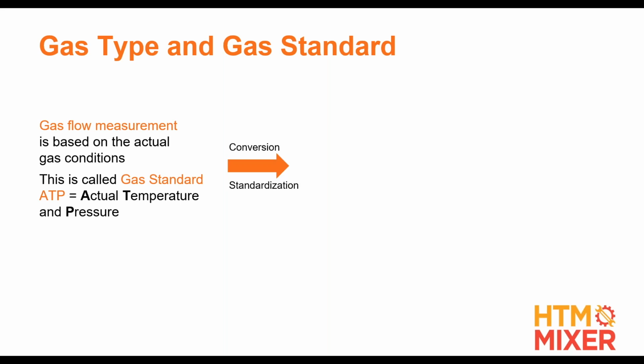How many people have heard of other gas standards, things like STP, BTPS, AP21, things like that, right? So all a gas standard is doing is adding an offset value to your ATP measurement based on the conditions of that gas, okay?